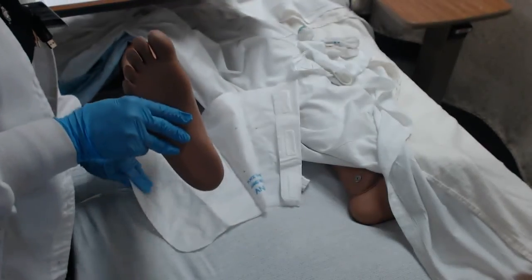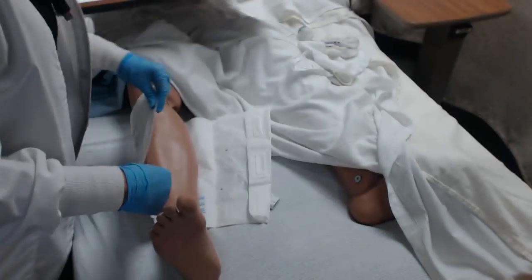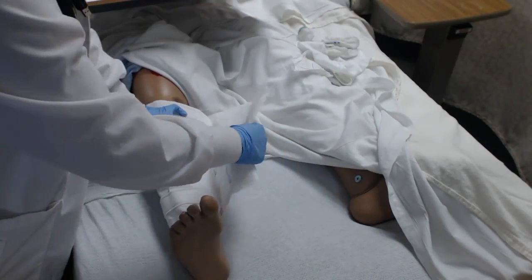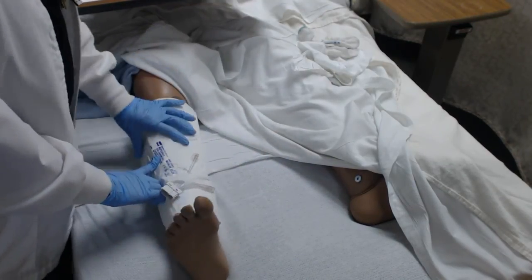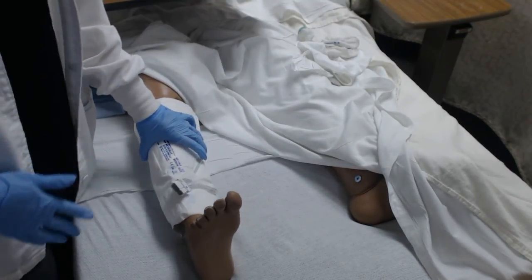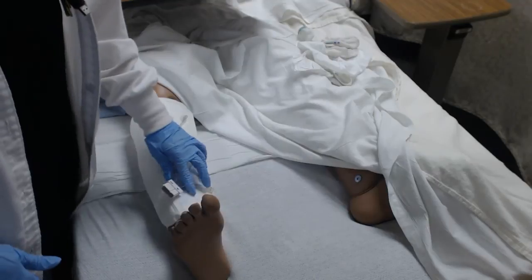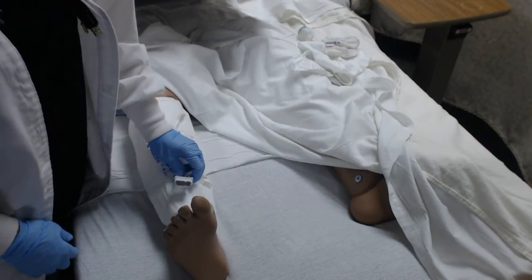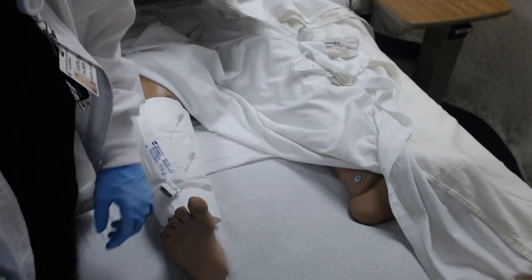And fairly not too complicated, it would wrap right around the calf. We're only measuring length now, unless we need a larger one due to calf size, but they're pretty generous in the size. And then you can see here there's this sort of piece hanging out the bottom. And that's what we're going to actually hook up to the machine.